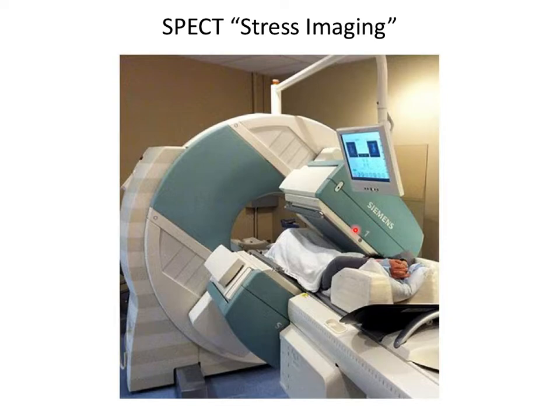So here's another configuration. We have two projections. Basically, they're measuring the same data for the same projection, just collecting twice as many photons, right? So we look at this projection through the patient from two directions and try to collect as many photons as possible.